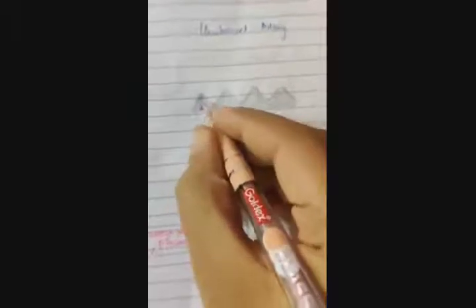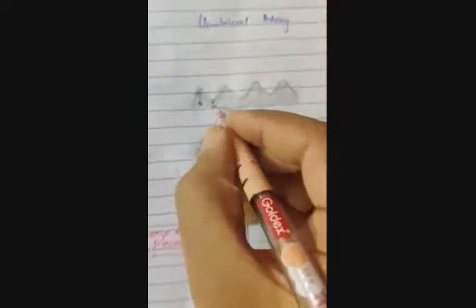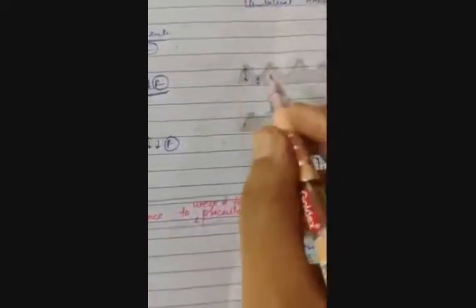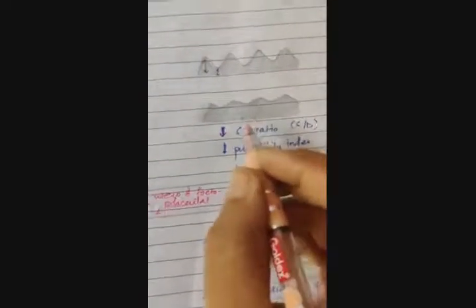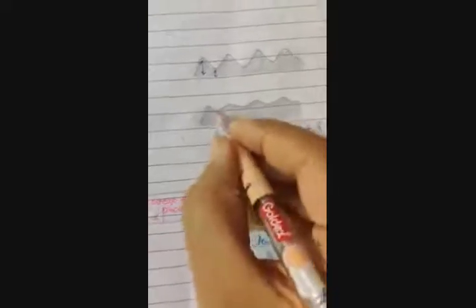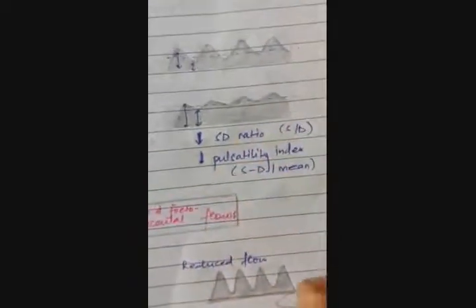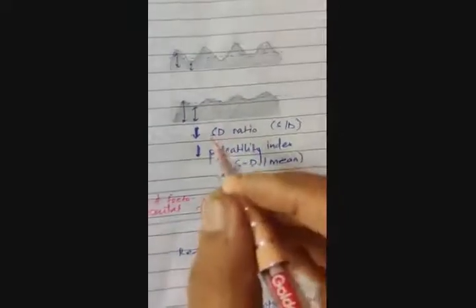Moving on to the umbilical artery. This is a visceral artery, right? So this is our forward systolic flow. This is our forward diastolic flow. This was somewhere in the second trimester. In the late second trimester and the third trimester, you notice an increase in diastolic flow. So if the mean flow was here, now it has gone up. Again, it makes sense because the umbilical artery is what is supplying the fetus finally.